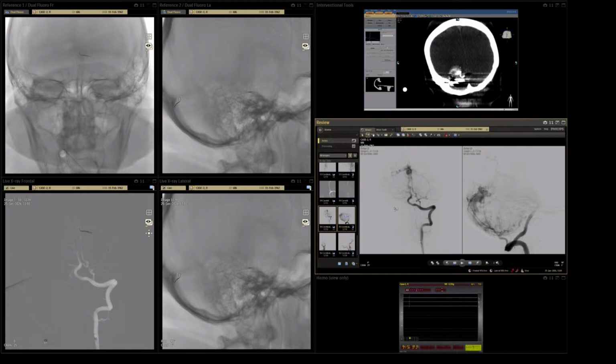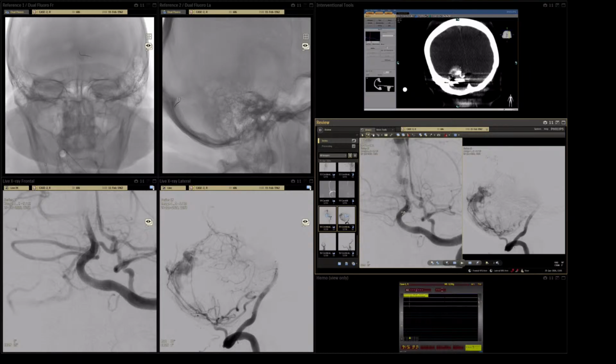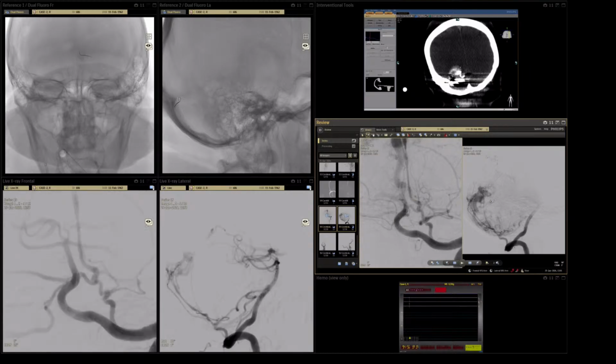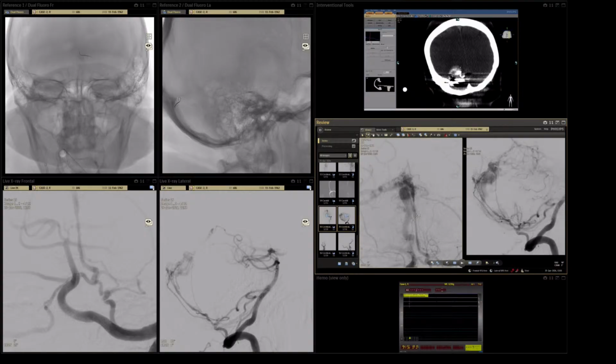Just a second. Okay. Now we have something here. Then we can go to the territory. I think it's possible to work from here. That branch is quite tortuous, this branch, and the catheter simultaneously went to this territory.